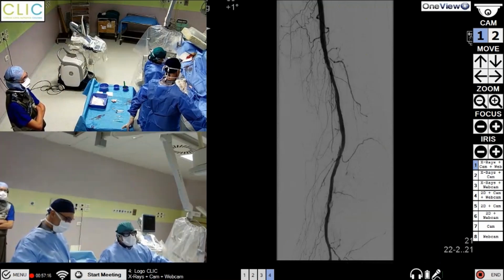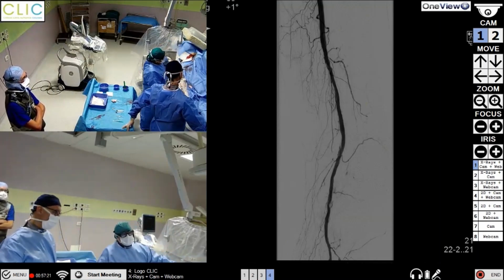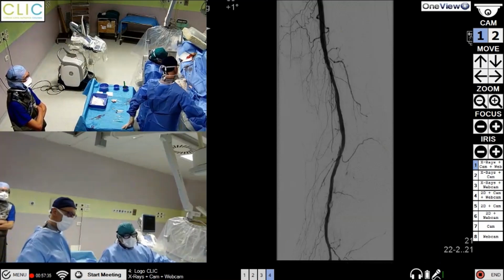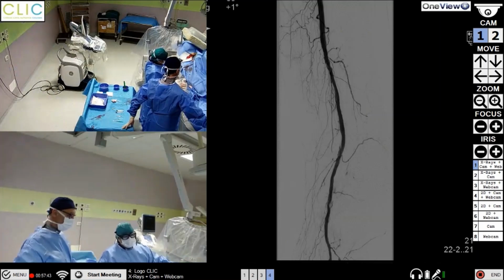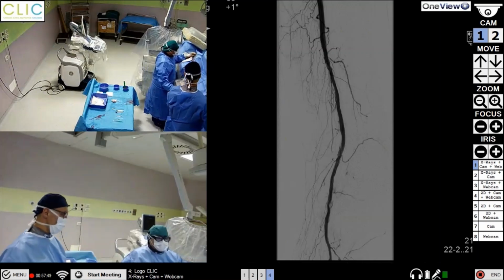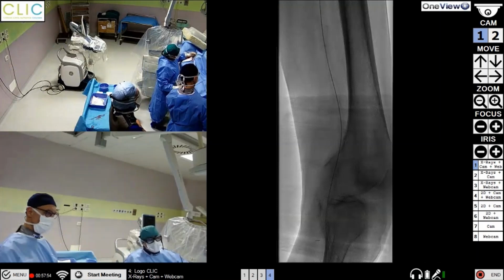So I thought, because the patient has a severe ankylosis of the knee, to prepare the vessel with a 6 millimeter Dorado balloon, and whenever needed, we could deploy a 5.5 Supera stent in that area to cover and resist the acute recoil. This is what we thought. What do you think about this strategy? I have the 6 millimeter Dorado balloon ready to go.